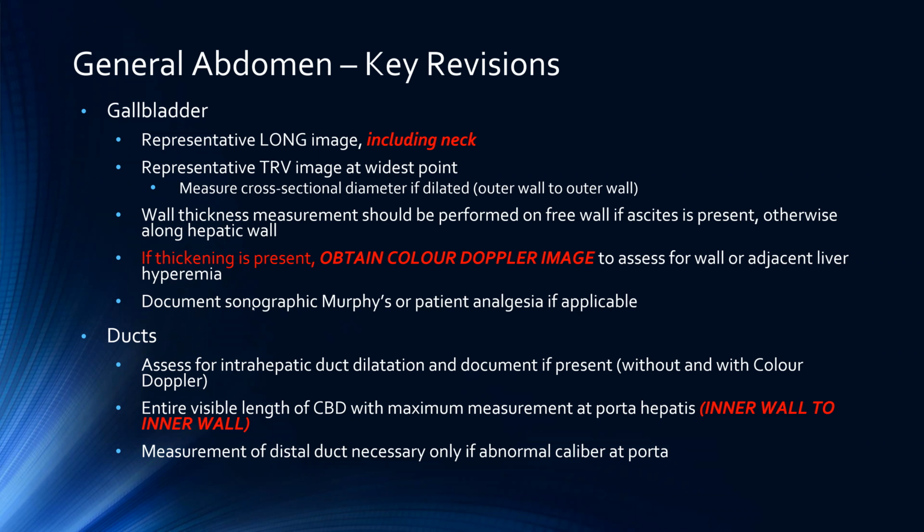Obviously, it's already part of our tech worksheet in terms of documenting sonographic Murphy's sign, but if the patient is on analgesia, this should definitely be documented as well, because then the assessment of the sonographic Murphy's sign is not reliable.